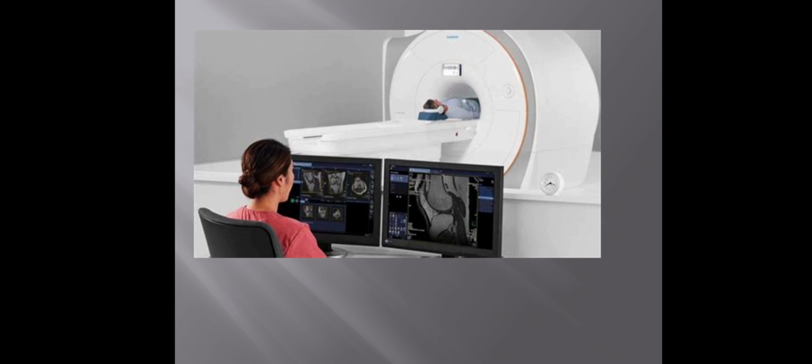MRI is widely used in hospitals and clinics for medical diagnosis, staging, and follow-up of disease. Compared to CT, MRI provides better contrast in images of soft tissues, for example in the brain or abdomen.